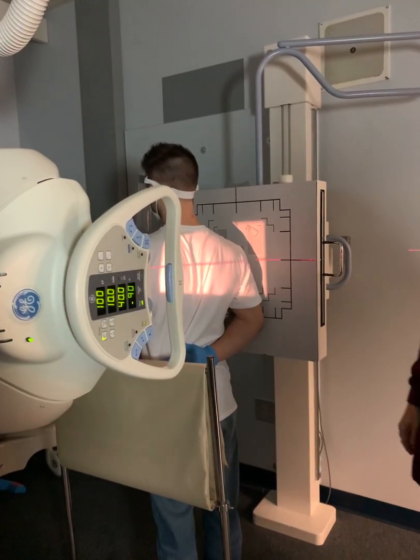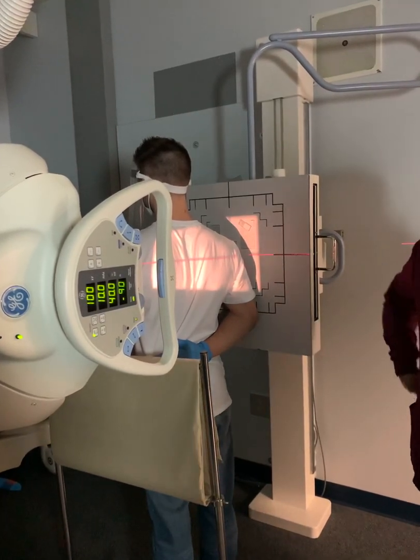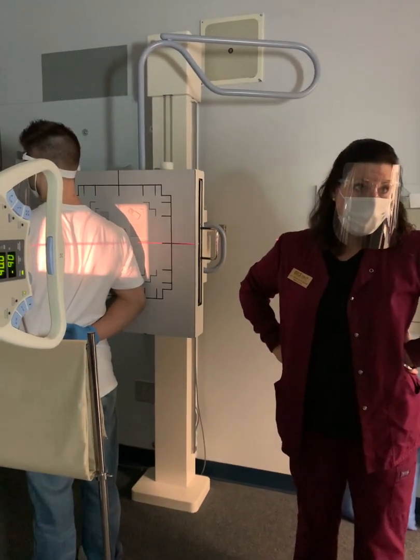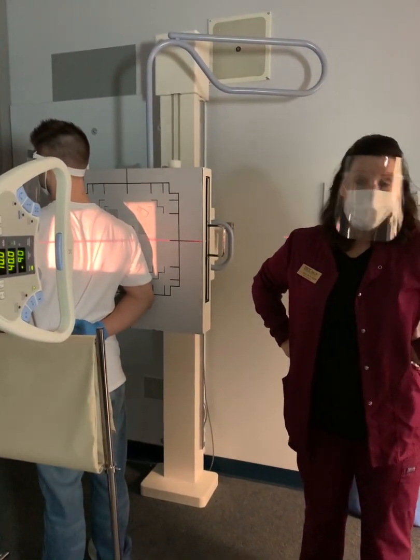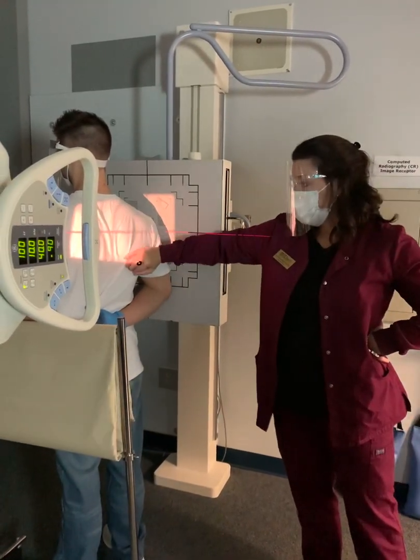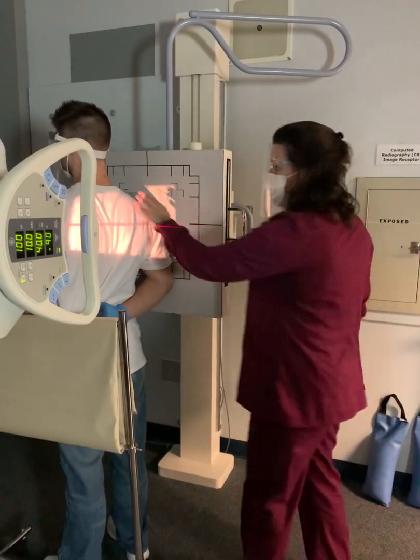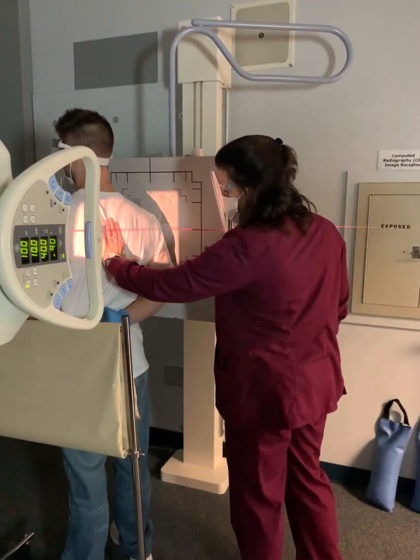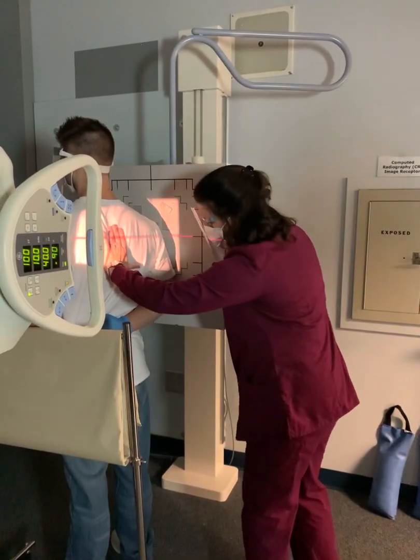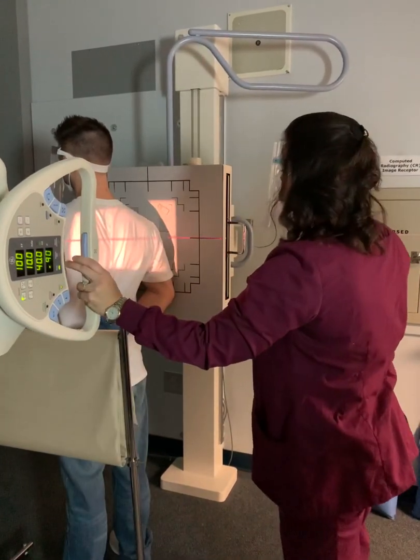Now, breathing technique. Hold your breath, don't breathe, don't move. That is a lateral scapula. Very similar to what you did with the scapula, right? Make sure you've got the entire scapula on the image. I think that's kind of close, isn't it? Here we go.